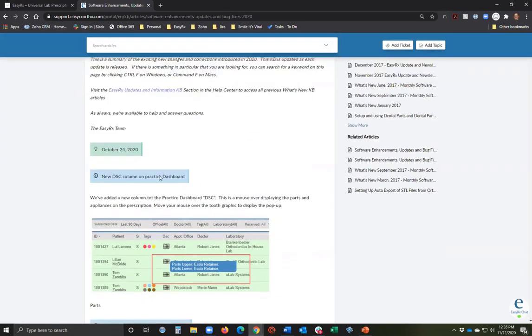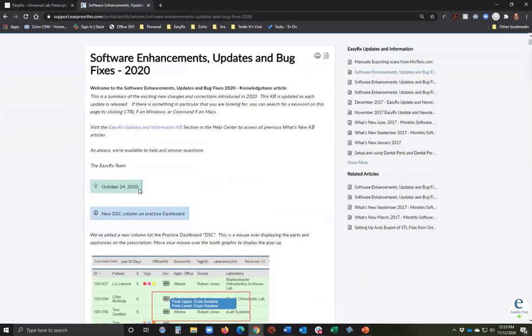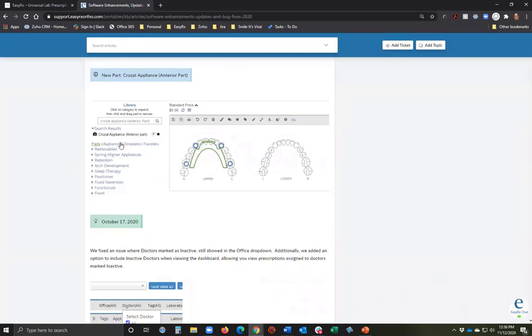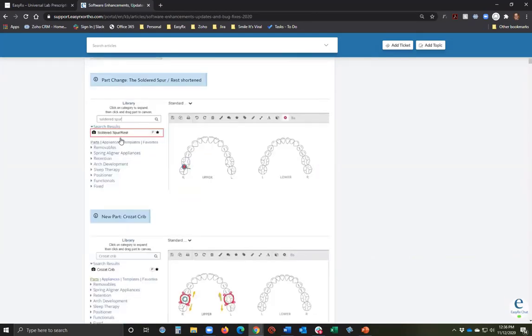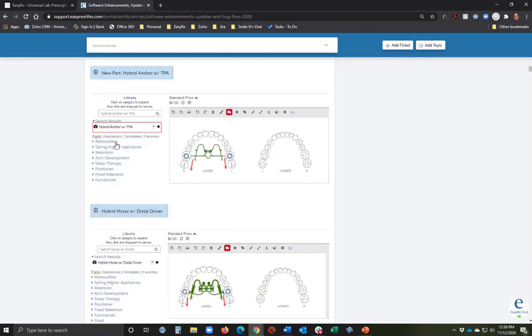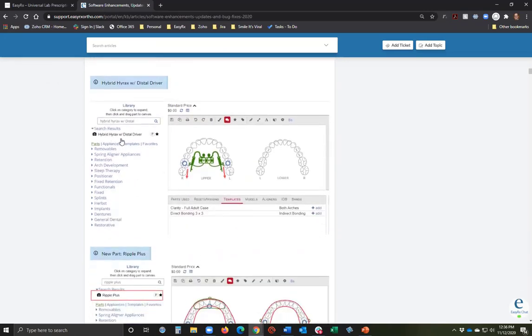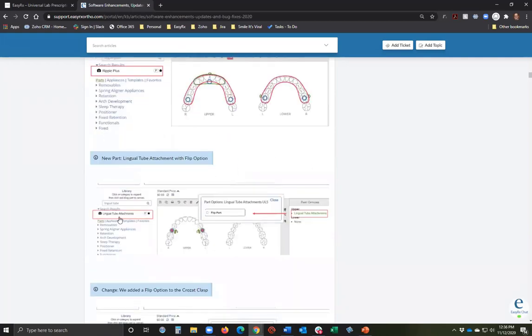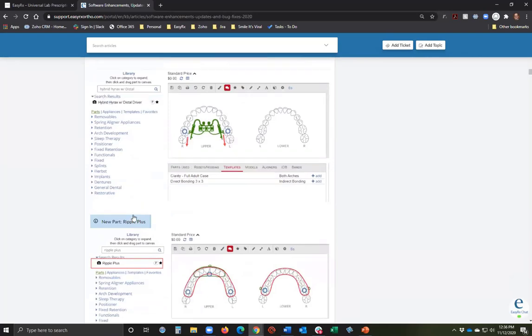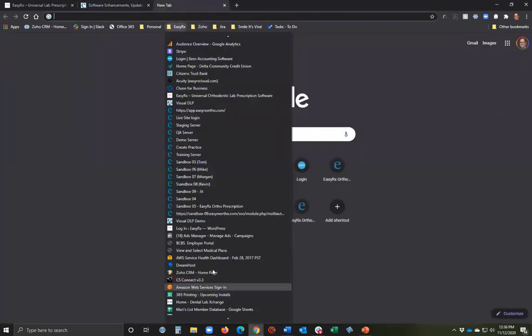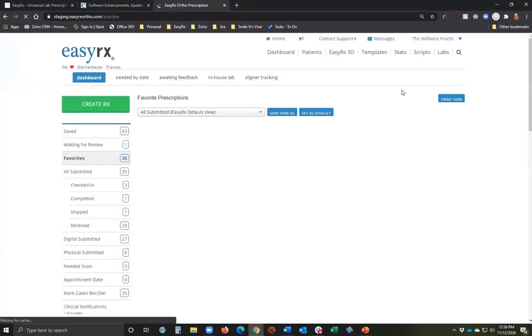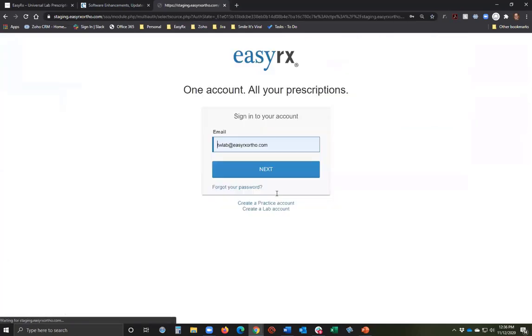When we add parts, they're active on the lab part list by default. Whenever we roll out a new part to EasyRx, a customer can send you a prescription for that part unless you choose to disable it. We document new parts in 'What's New' under the knowledge base. For example, we recently put out a crozat appliance, soldered spur rest, crozat crib, hybrid anchor with TPA, hybrid hyrax, distal driver, and ripple plus lingual tube attachment.